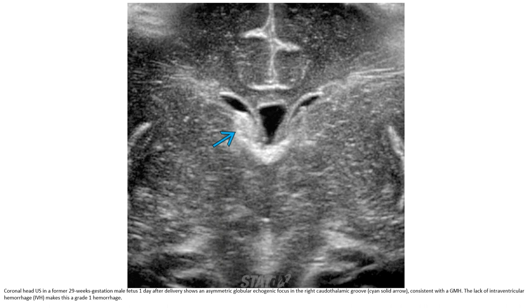This is the ultrasound of a 28-week gestation male fetus one day after delivery. There is an asymmetric globular echogenic focus in the right caudothalamic groove, consistent with a germinal matrix hemorrhage. The lack of intraventricular hemorrhage makes this a grade one hemorrhage.